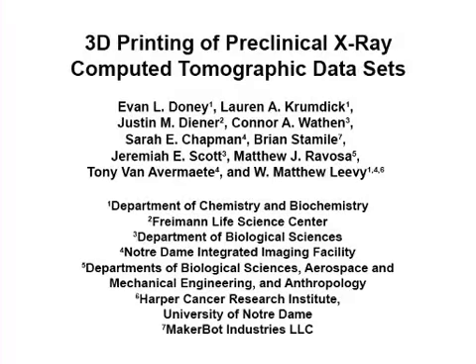The overall goal of this procedure is to create anatomical models of preclinical X-ray CT datasets using 3D plastic printing technology.